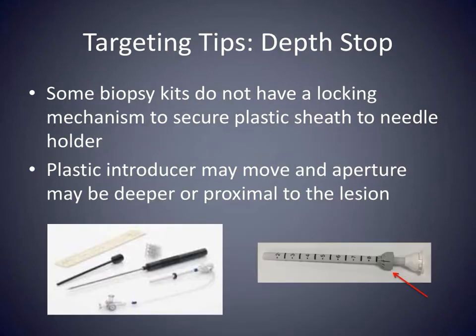It is also important to keep in mind that some biopsy kits do not have a locking mechanism for their depth stop. So the plastic introducer may move deeper or more proximal depending on how much force you use during the biopsy.